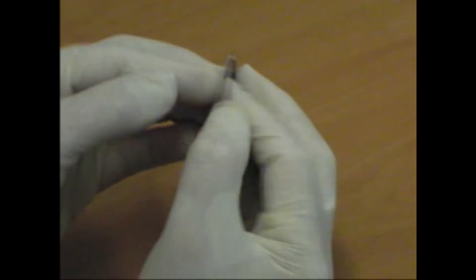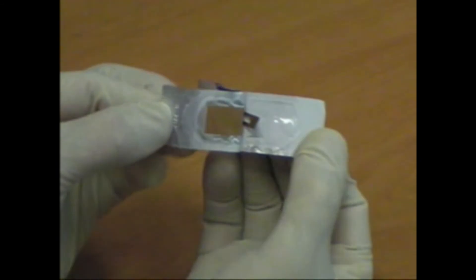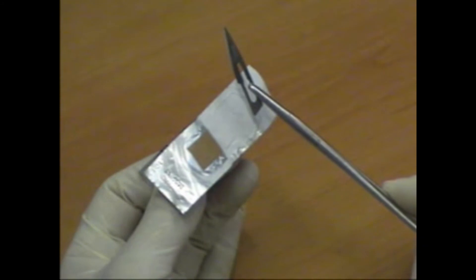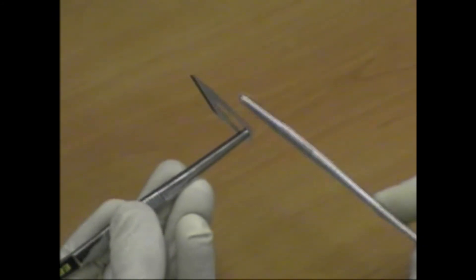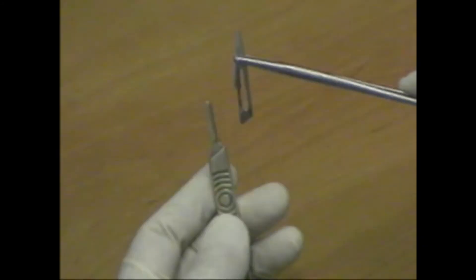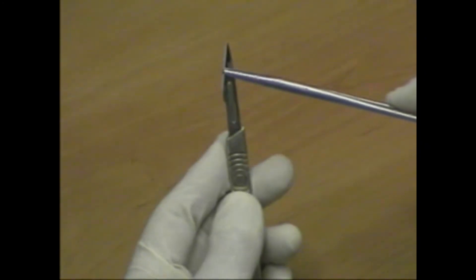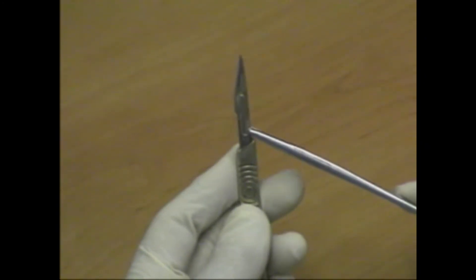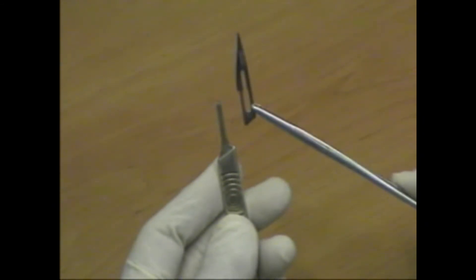Care should be taken handling all sharps, using instruments and never the hand. The scalpel blade is carefully removed from its packet using needle holding forceps. It is held at its tip, allowing it to be attached to the handle. It is also removed with forceps and carefully disposed of into a special sharps bin.